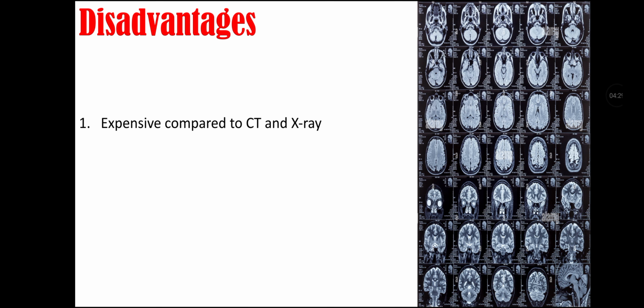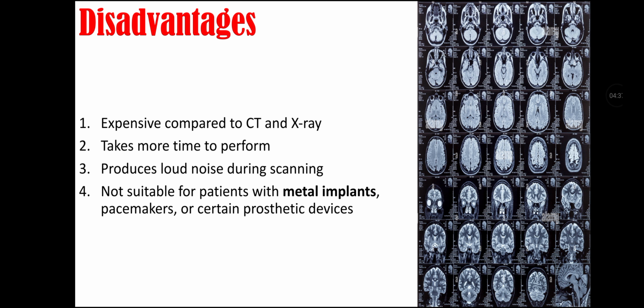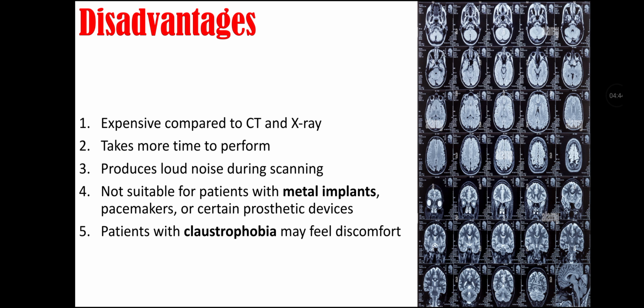Disadvantages of MRI. It is expensive compared to CT and X-ray. It takes more time to perform. It produces loud noises during scanning. It is not suitable for patients with metal implants, pacemakers, or certain prosthetic devices. And patients with claustrophobia may feel discomfort.